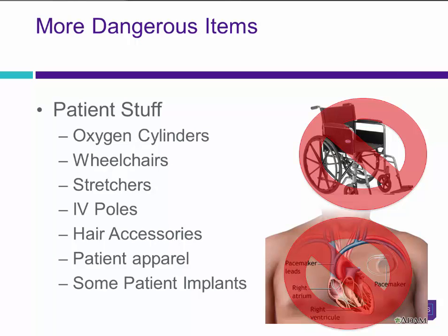Additionally, extreme care should be used by communicating about patient equipment with the MRI technologist when bringing things into the MRI suite. Almost all patient items used throughout the hospital have magnet-safe equivalents for use in the MRI suite, including oxygen canisters, chairs, wheelchairs, stretchers, and IV poles.